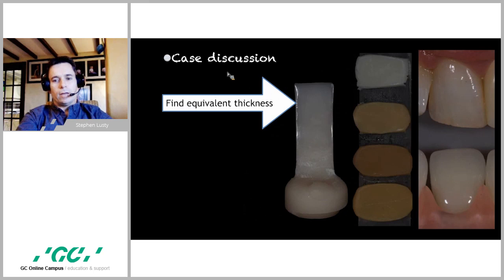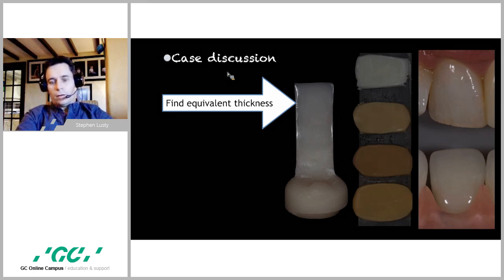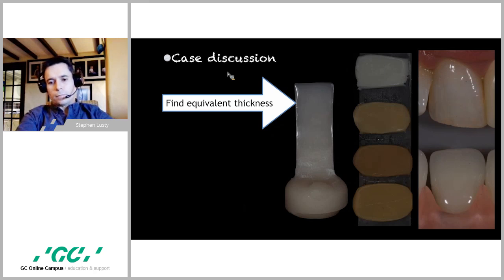The stump shade is pretty much an A3 dentine shade. Now, the other important thing to notice here is that when I take a shade, I use this Dragon Shade Guide by Hellman Dental, or Jan Hellman, sorry. And this influence of the pink onto the shade tab makes the world of difference, as you can see in the neck area of this shade tab compared to the neck area of the natural tooth. I think it's an invaluable way of taking shades, and I wouldn't take a shade anymore without this pink in place.